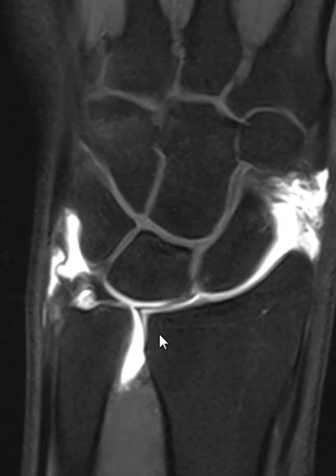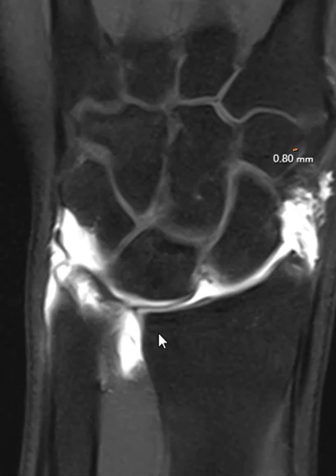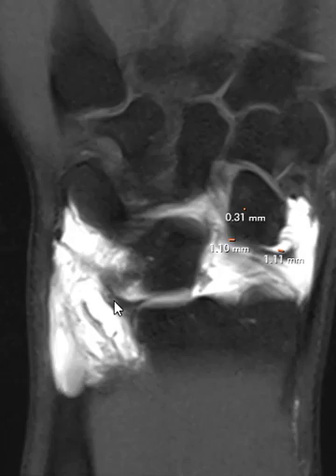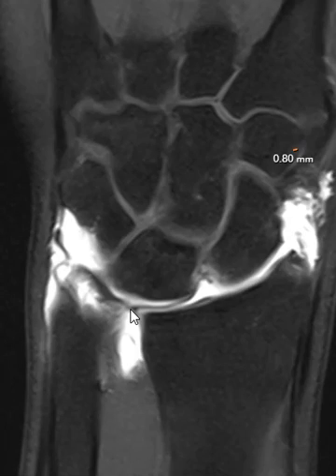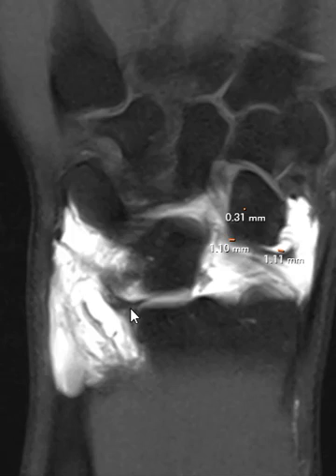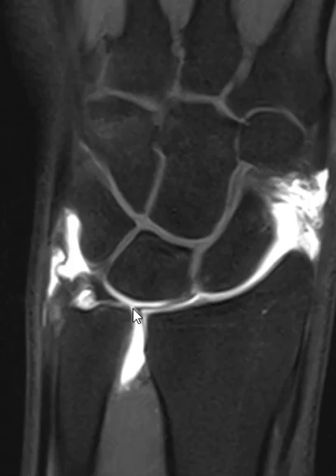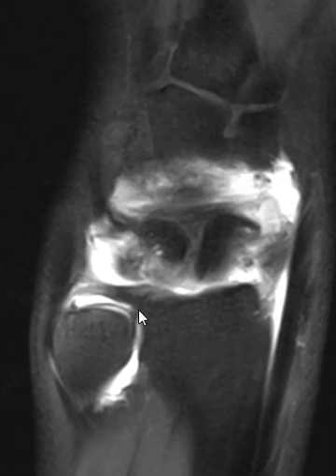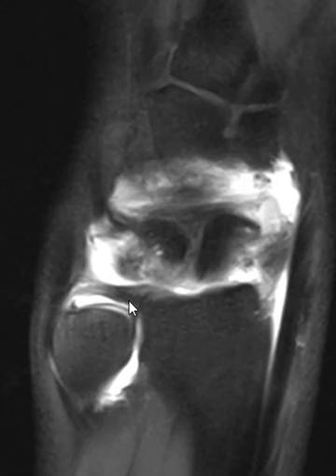Now this patient also had — if we go to the palmar aspect, this is the palmar band. It looks kind of thin and attenuated, so I believe the tear went from the central disc into the palmar band. And if we go towards the dorsal band, it looks a little bit thicker and better.